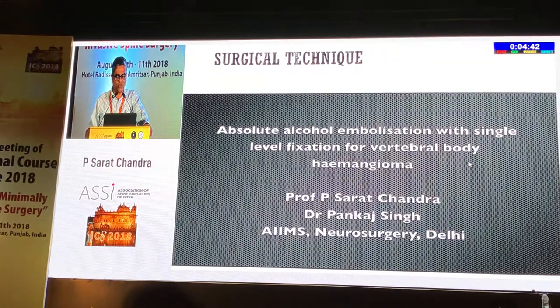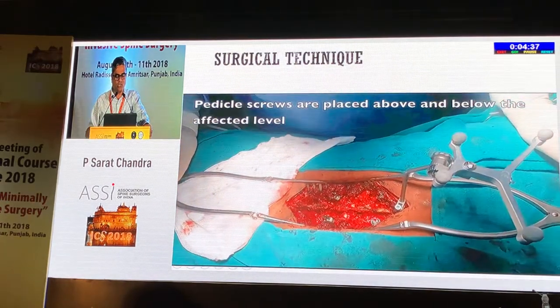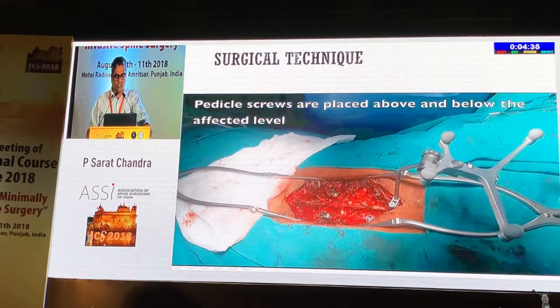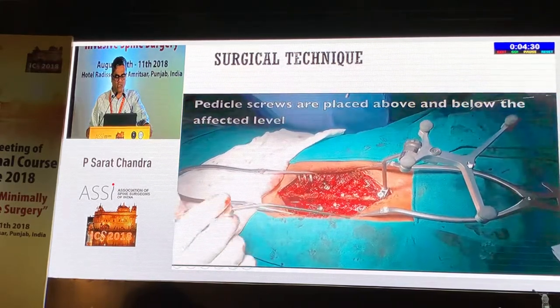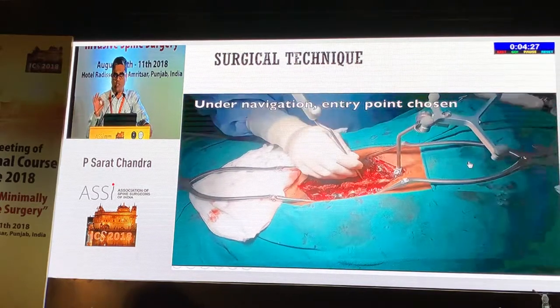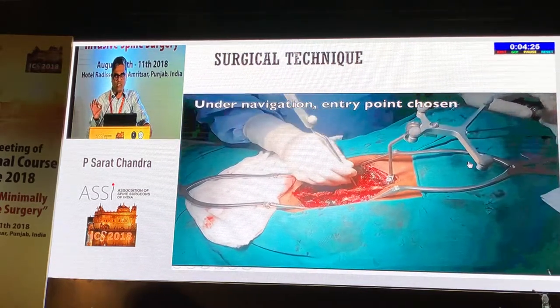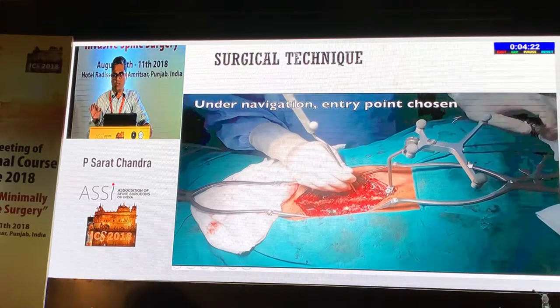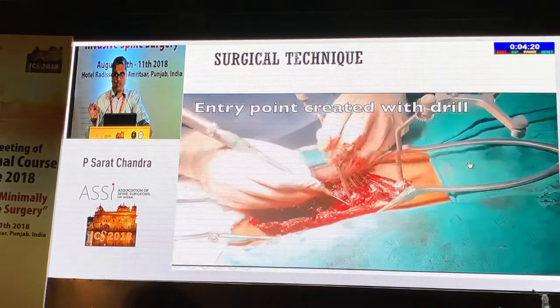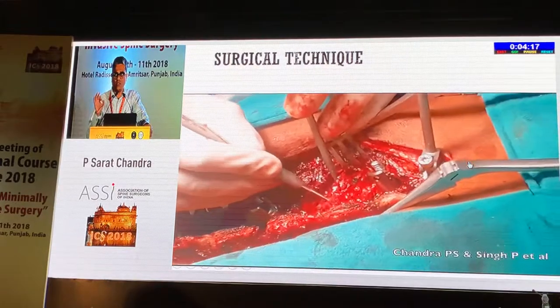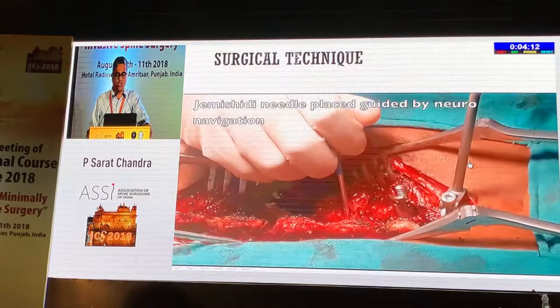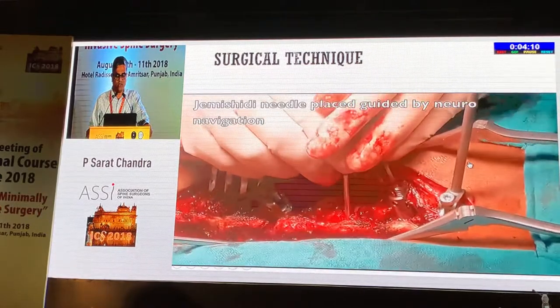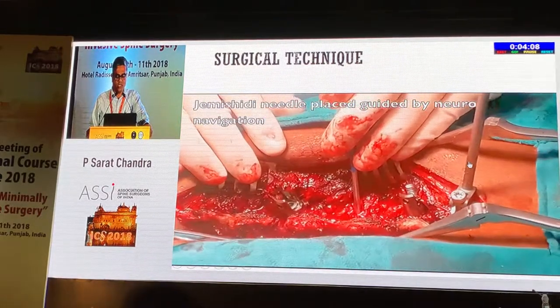This is to show you briefly how the surgical technique is done. Once we place the pedicle screws both above and below the affected levels, there are certain nuances which have to be followed very rigidly, because whatever substance you are injecting is highly toxic. The whole idea is to use it in a very careful and controlled manner. The first step is to make a hole and pass the Jamshidi needles guided by neuro-navigation into either pedicle.